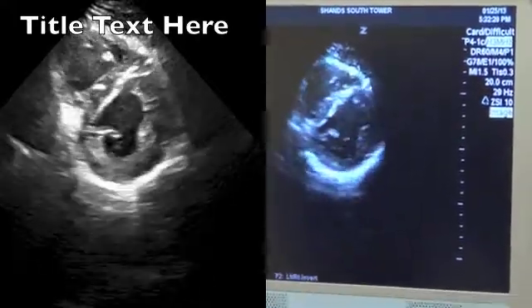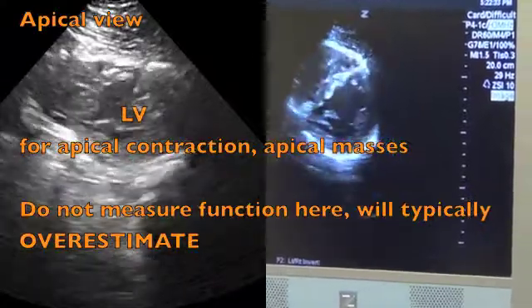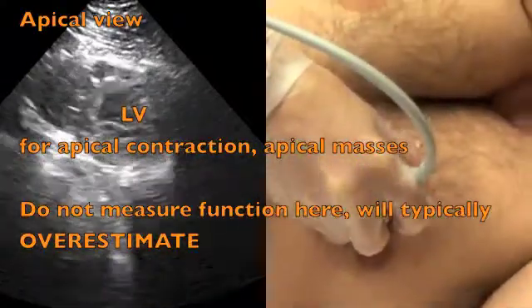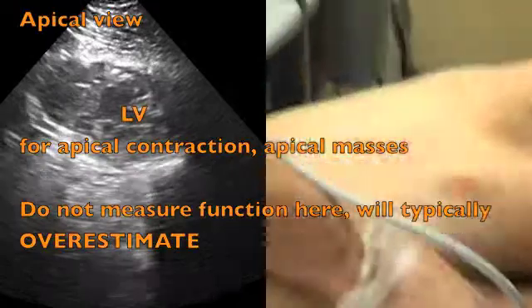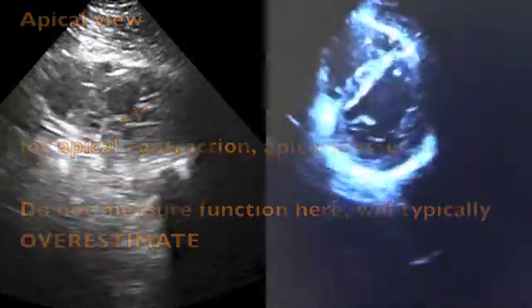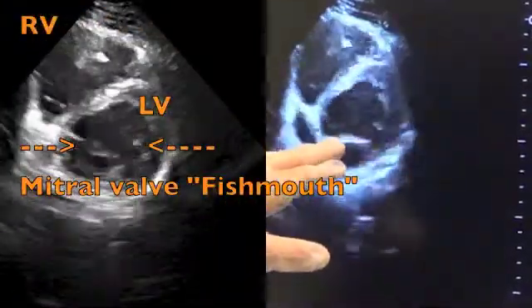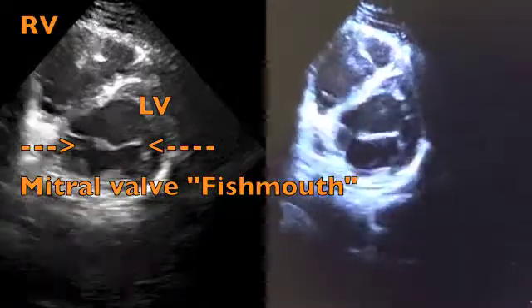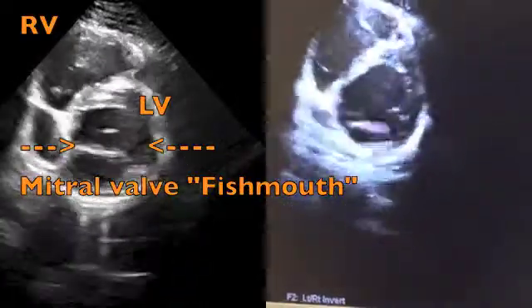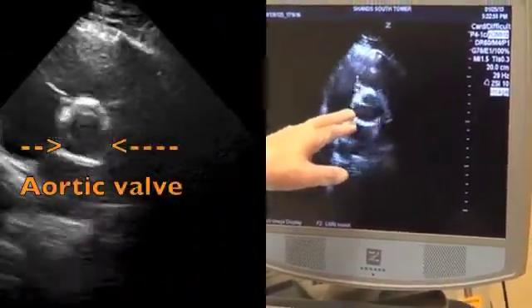From the view at the papillary muscles, we can fan downward towards the apex, evaluating for apical contraction. Or we can fan upward towards the right shoulder until we can see a fish-mouth-like valve coming into view — this is of course the mitral valve. If we keep fanning up from this point, the aortic valve comes into view, which you can see is a tricuspid valve.